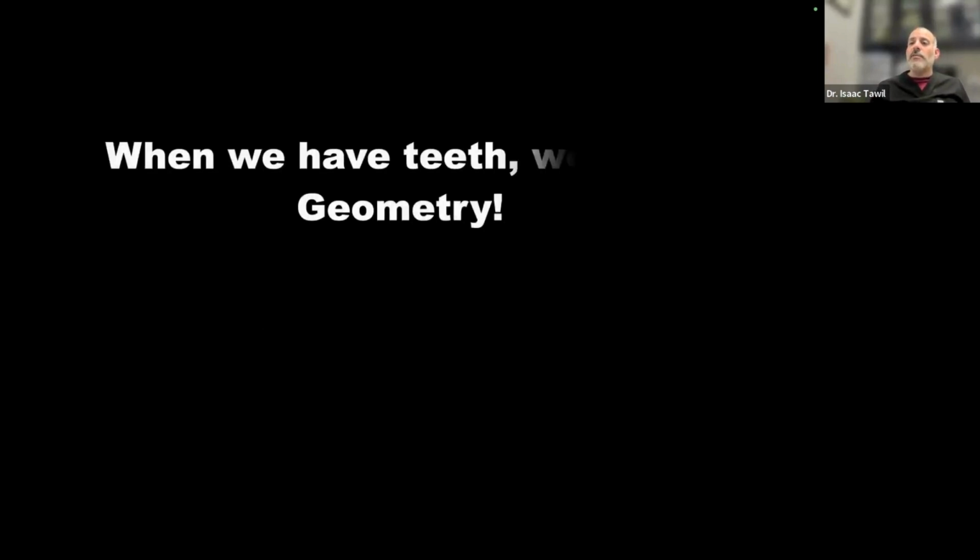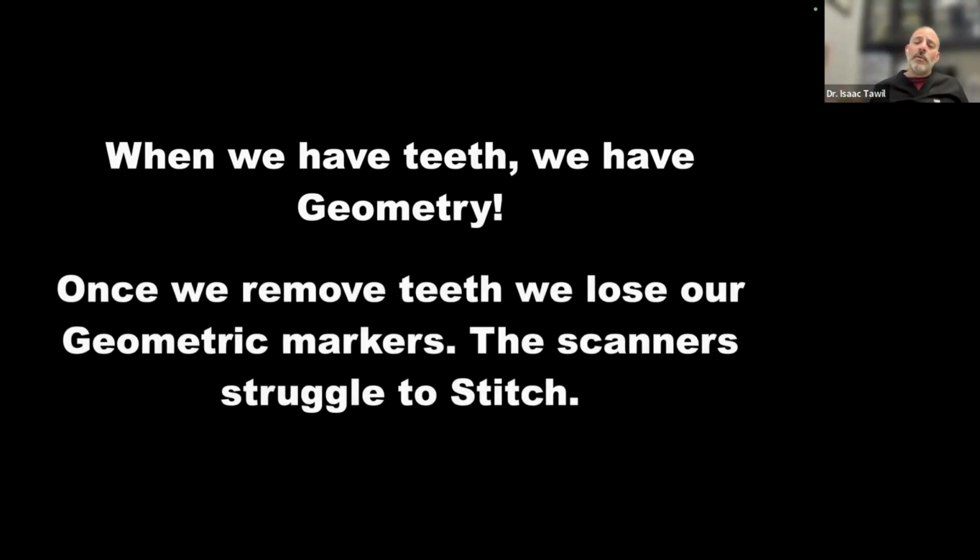And the main problem that we have is as soon as we extract teeth, once we remove the teeth, those are our markers, those are our landmarks, and we lose tremendous amounts of geometry. Now we have to rely on tissue, and tissue is movable. Tissue becomes the issue. We end up starting to have our reference frame completely lost.